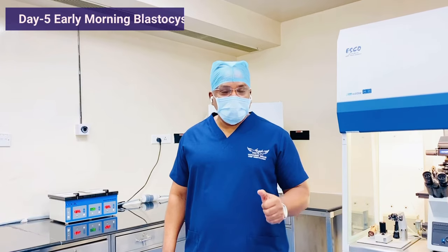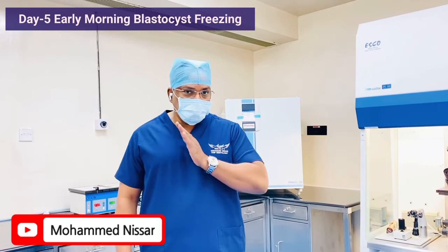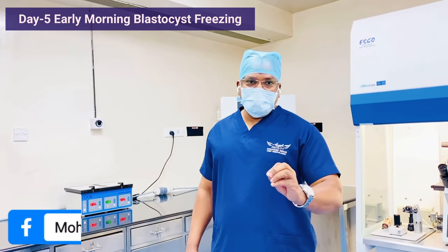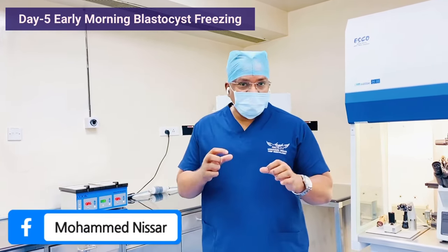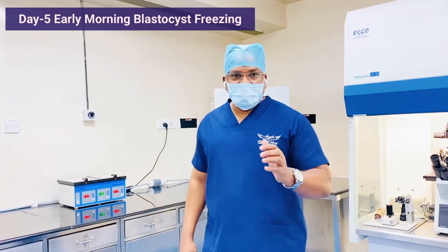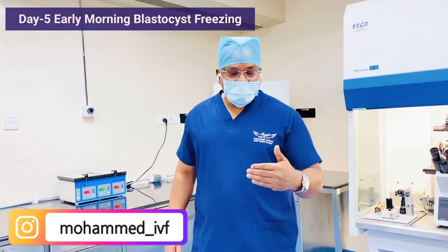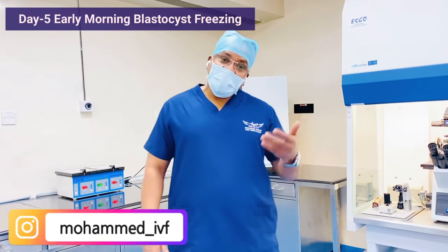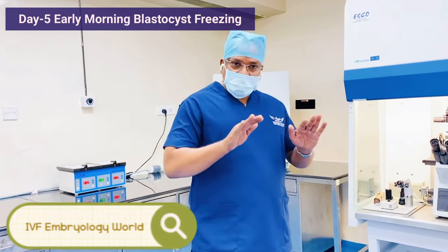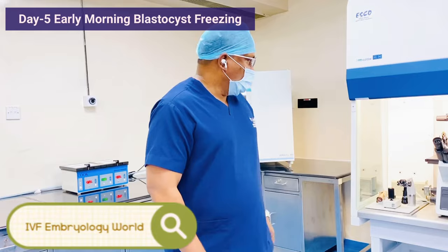Good morning. Today we came early in the morning to freeze the blastocyst. Five days back we did ICSI and it was a perfect ICSI, and on day three we observed beautiful day three embryos, timely growing, a little bit speedy also. Some of the embryos on day three were compacting, so we decided that when day five comes, they will reach blastocyst very early in the morning. And we decided to come for the blastocyst because we don't like the blastocyst to go into a hatching phase. So we came early in the morning to freeze.